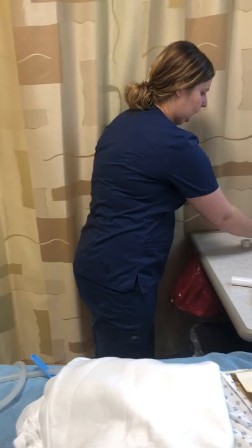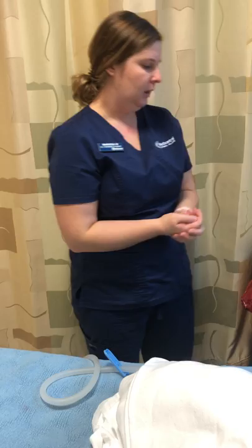I'm going to dispose of my supplies, throwing everything away that needs to go in the garbage, and the dressing in the biohazard bag. Then I would put my client back together here. I would ensure patient safety by lowering the bed, and I would put the head of the bed at a semi-fowler's position to help with the draining of the chest tube. When I'm done with that, I would wash my hands before leaving the room.